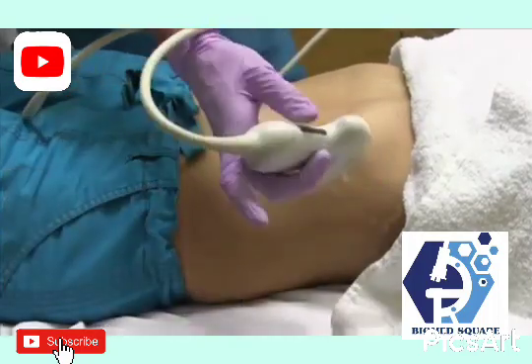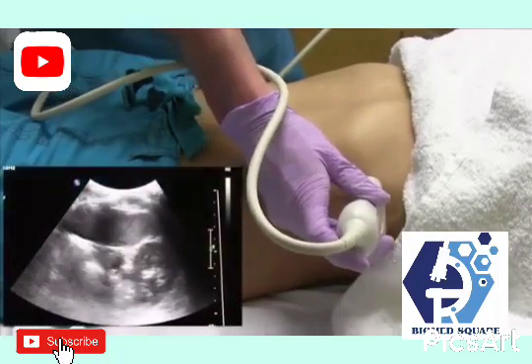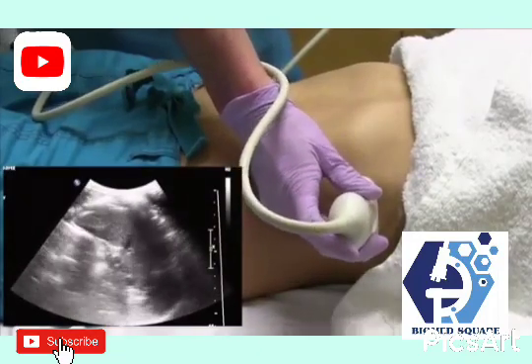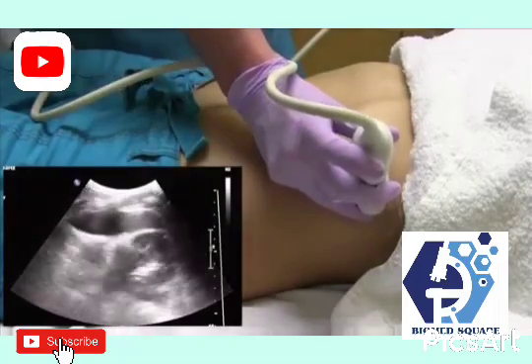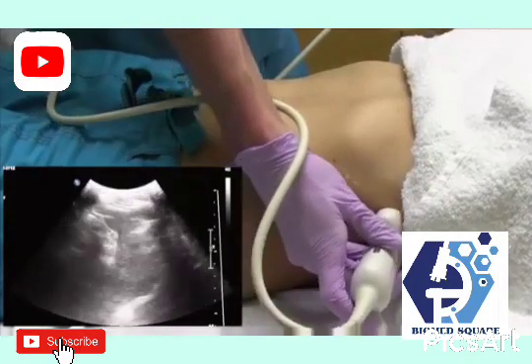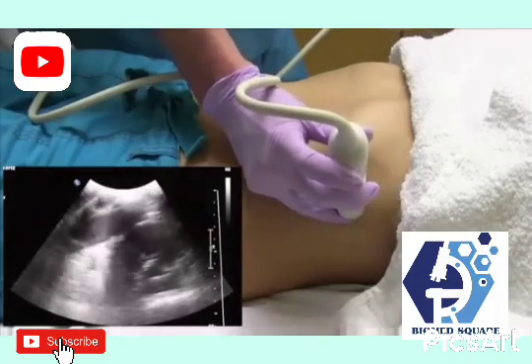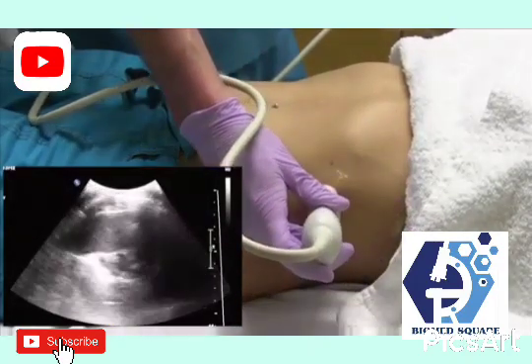For your transverse images of the spleen, you may see some of those rib shadows in your view. But all you can do is angle, maybe come a little more anterior or posterior to get around those ribs, and just sweep through as much of the spleen from these different windows as possible until you feel like you've seen the entire spleen.